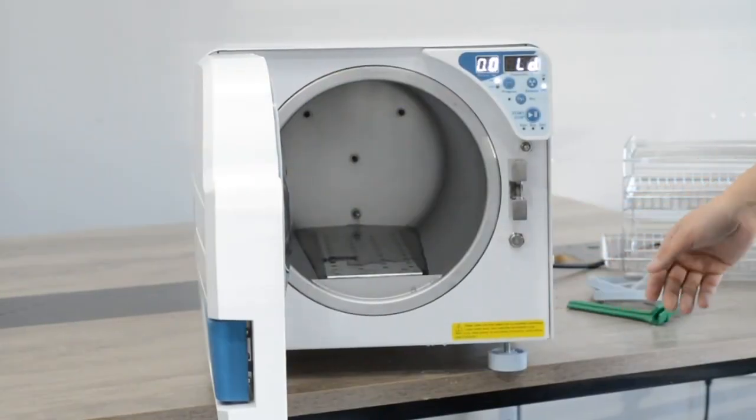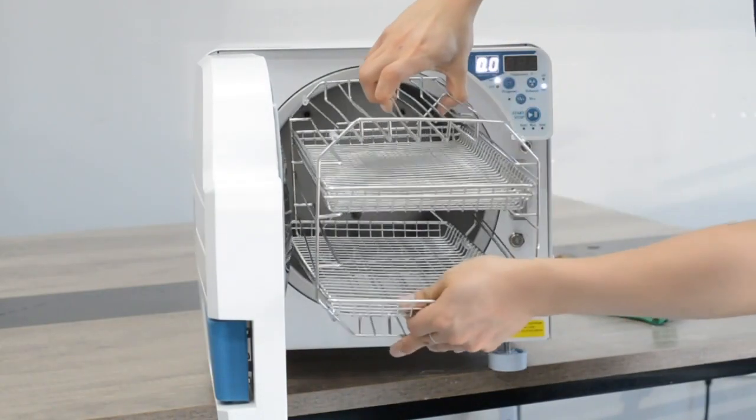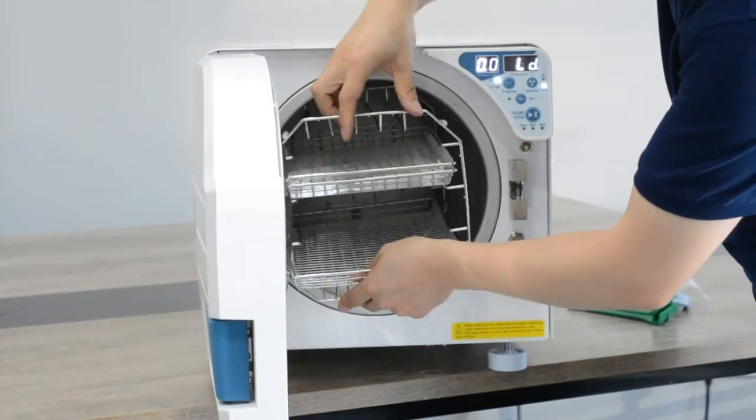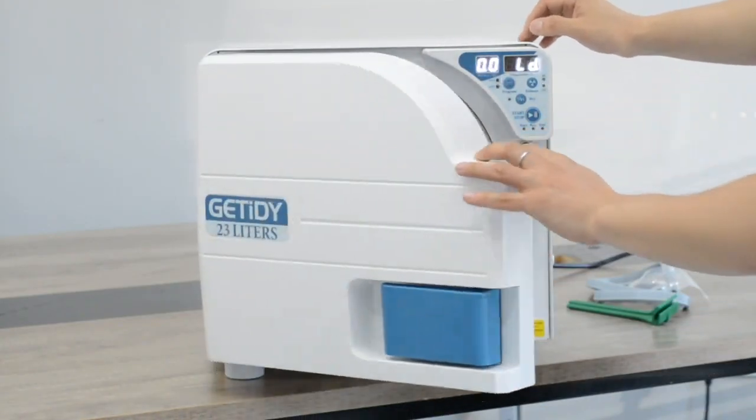Turn on the power and load the tray and tray rack, as well as your instrument. Then we can close the door.